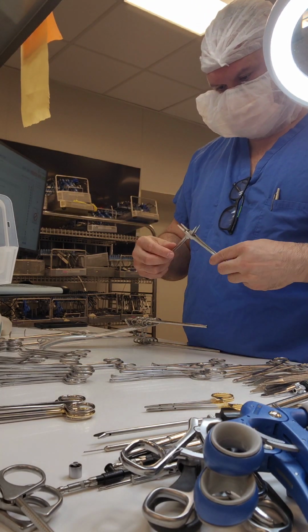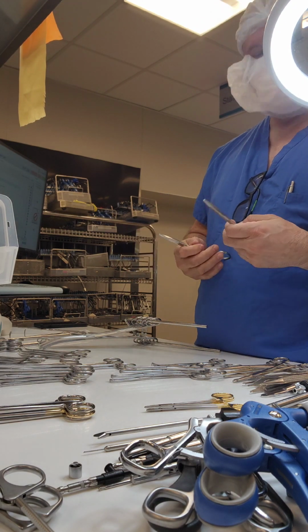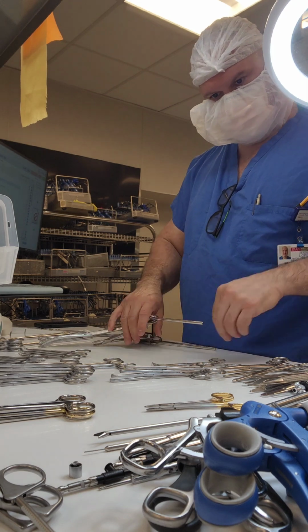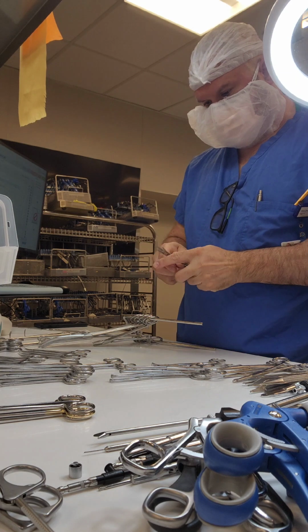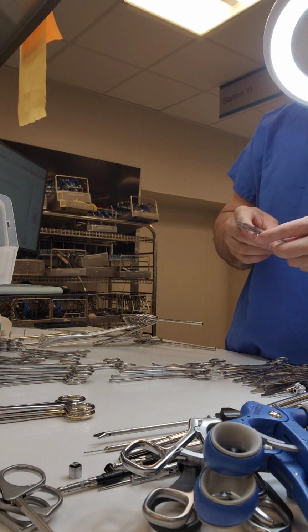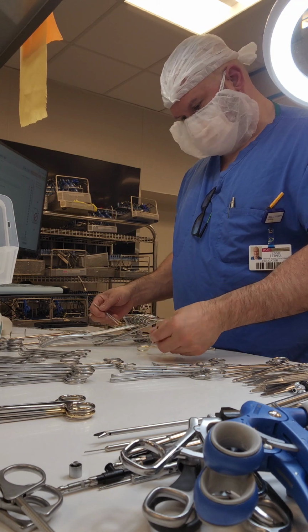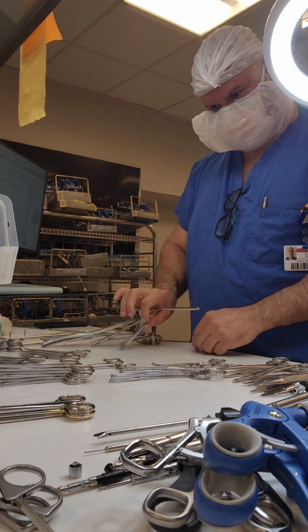I'm looking at needle drivers. You see I do the illumination test to see if any light goes through the jaw, inspect that box lock, inspect that tungsten carbide insert, and then do my little tap test, right? Okay, next needle holders here, doing the same thing. Illumination test, looking at those jaws, okay, under lighted magnification again, making sure there's no cracks or anything like that, because tungsten carbide inserts are very susceptible to cracks and chips, so you want to look out for that.